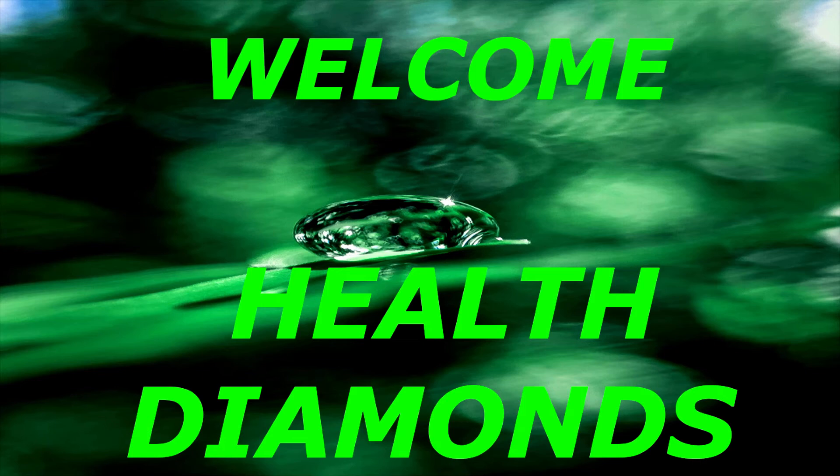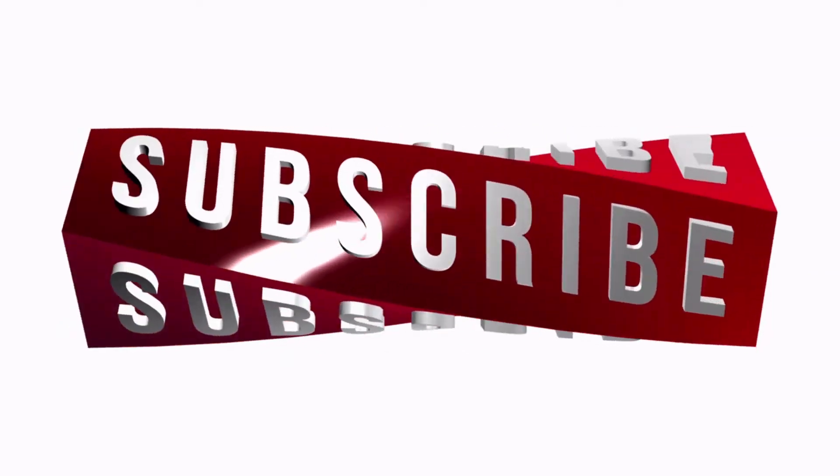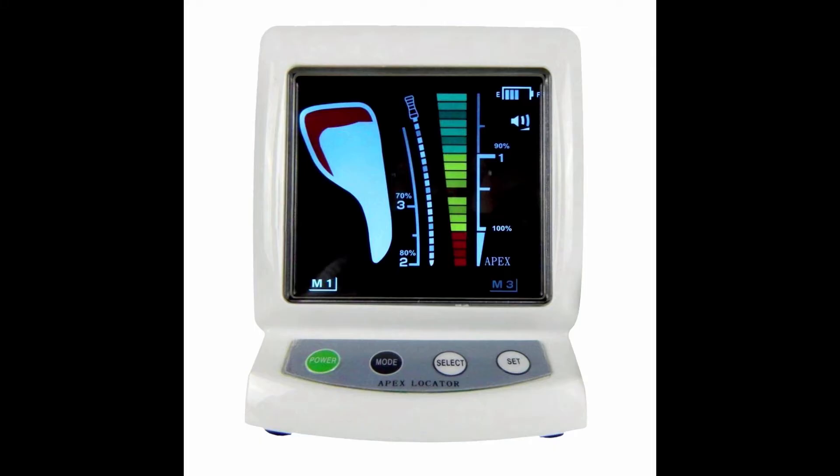Welcome to my YouTube channel Health Diamonds. Today we look at the Dock Royal Apex Endodontic Root Canal Locator.